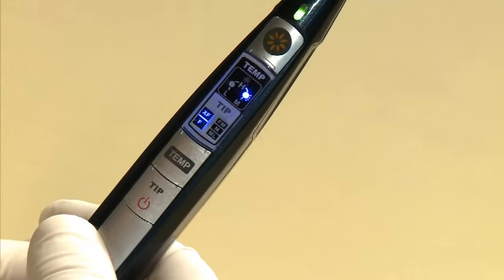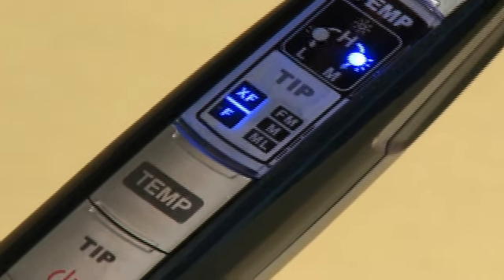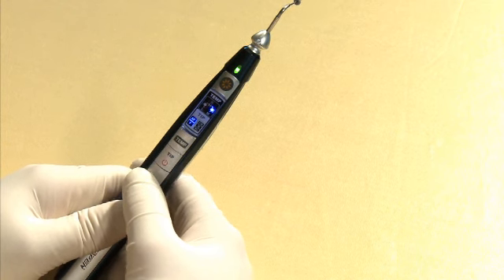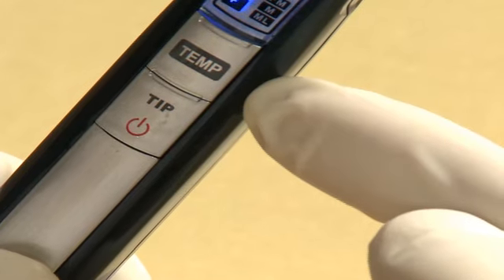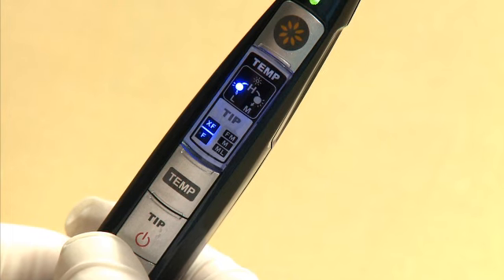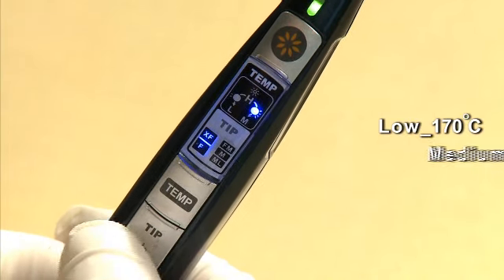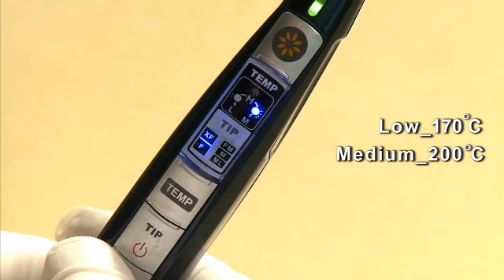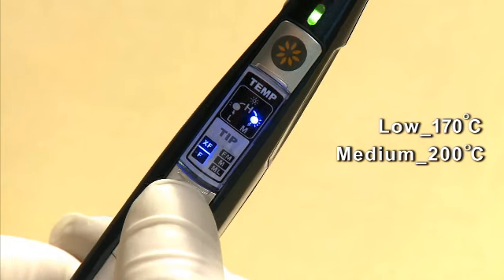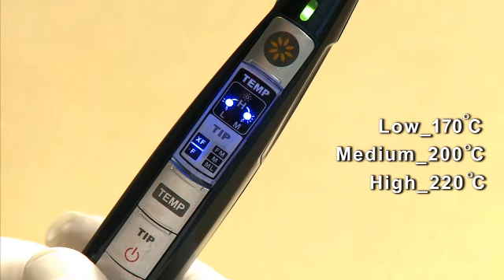The default setting for temperature is medium, which is indicated by the M indicator on the handpiece. Press the temp button, which is above the power button, to change the temperature setting. The low setting has a temperature of 170 degrees Celsius, the medium setting is 200 degrees Celsius, and the high setting is 220 degrees Celsius.